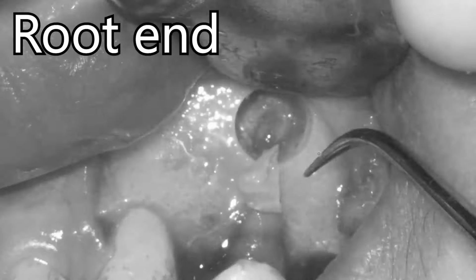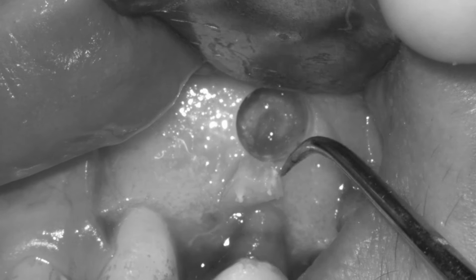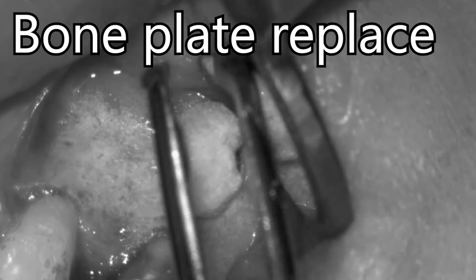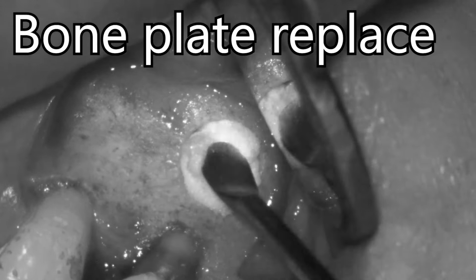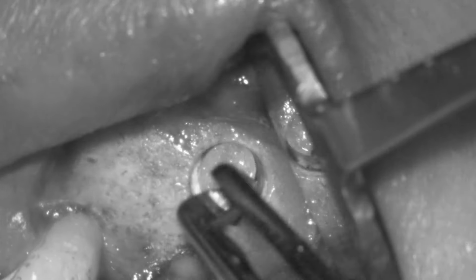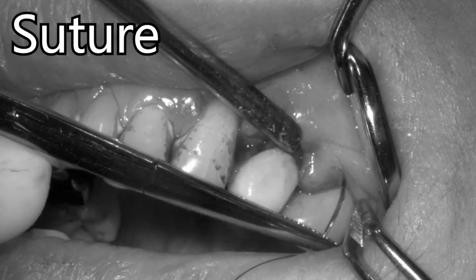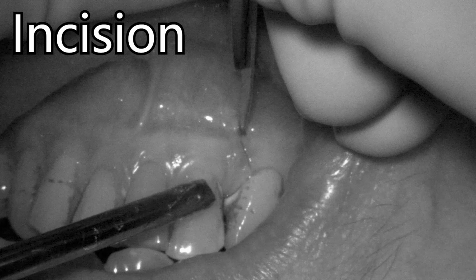You might find that you drill around and try to find the apex. And if you use the surgical guide, it's easier. And I used the trephine bur to remove the apex simultaneously. But it is not necessary to use the guide plate to remove the apical part. You can use the old way to cut it. That's all fine. And I placed a little collagen material and put the bone plate back and sutured it.